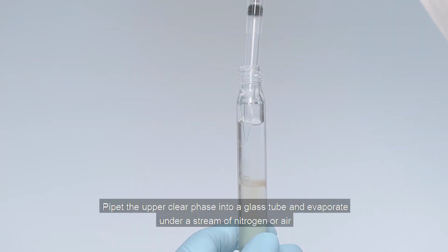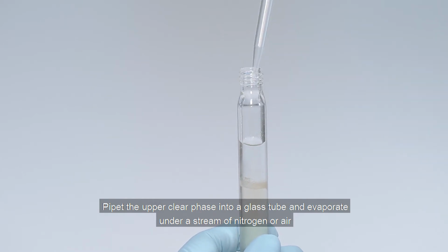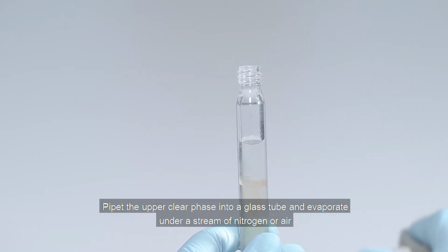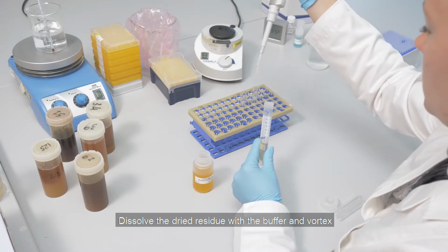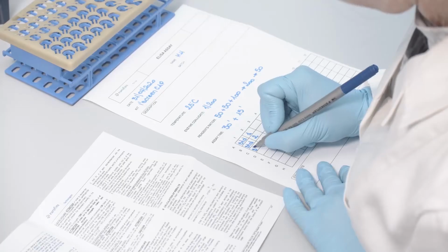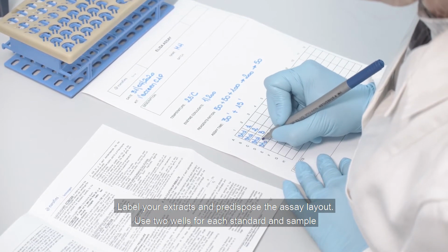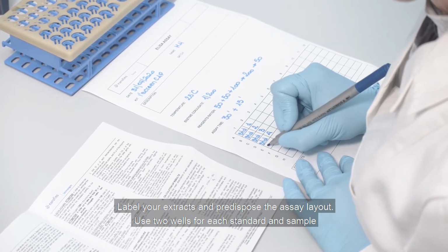Pipette the upper clear phase into a glass tube and evaporate under a stream of nitrogen or air. Dissolve the dried residue with the buffer and vortex. Label your extracts and predispose the assay layout. Use 2 wells for each standard and sample.